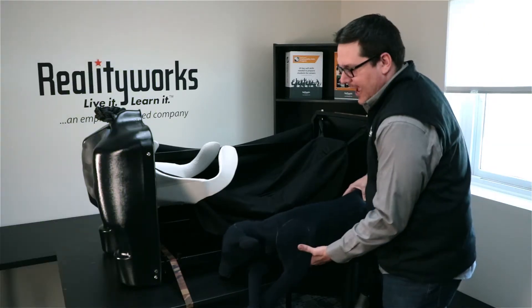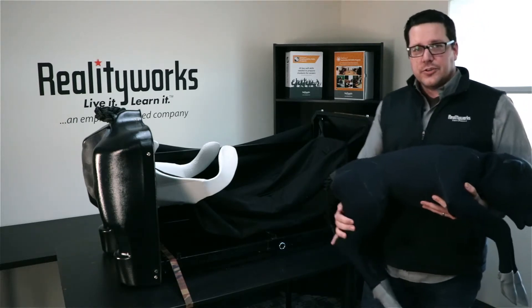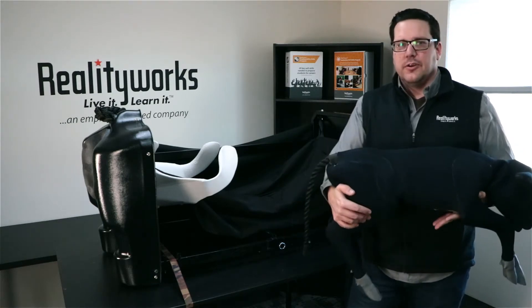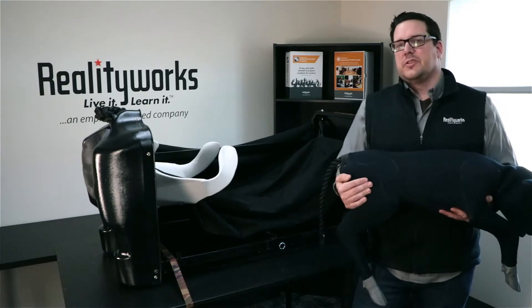We have our calf here. I'm going to pick it up — it is a heavy calf. It has a lot of the features of a newborn calf, so it allows you to use it out in the open or with the birthing simulator to do a simulated birth.